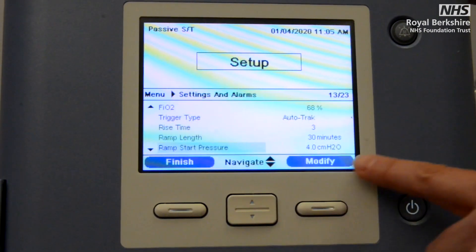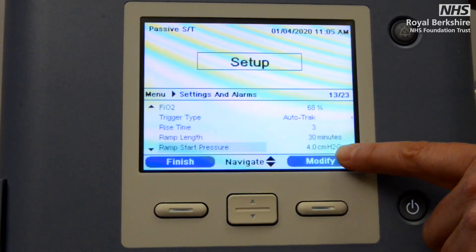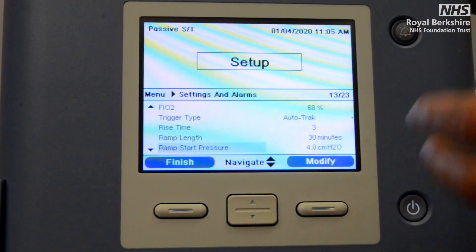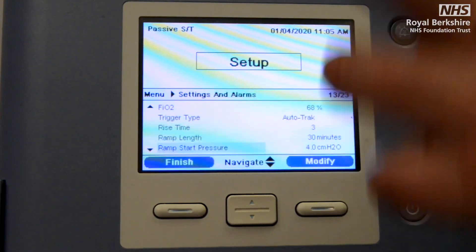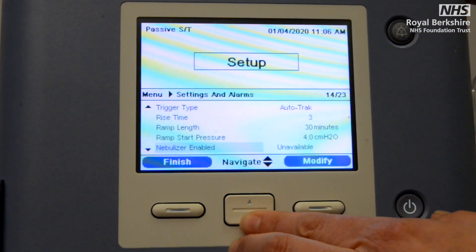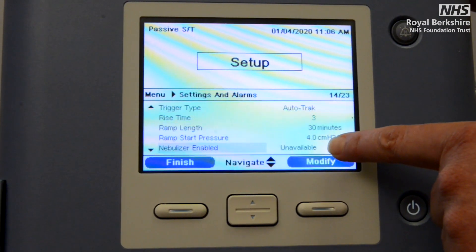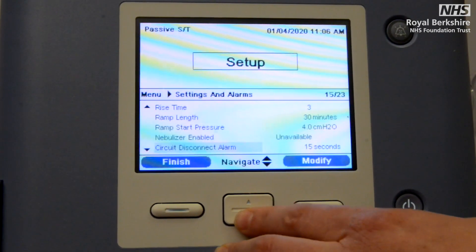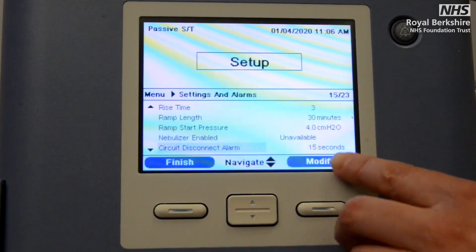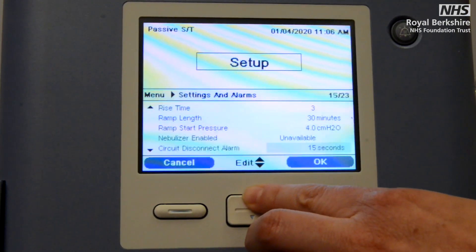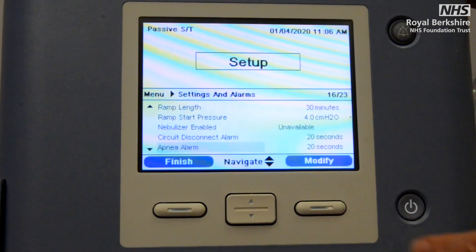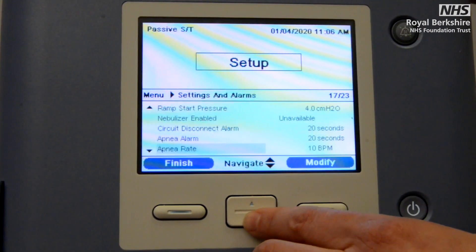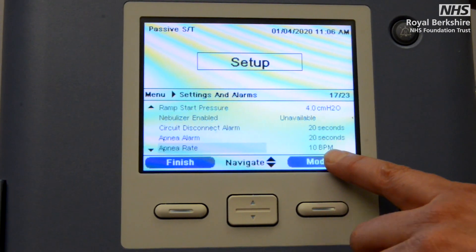Ramp start pressure: exactly the same principles as before — it needs to be either at the same setting as your EPAP or slightly below, so that the machine can titrate up accordingly. Then we're down to nebuliser enabled — unless you're working in AMU where you have the nebuliser attached, this needs to be set to unavailable. The circuit disconnect alarm needs to be set at a maximum of 20 seconds — no more than that.